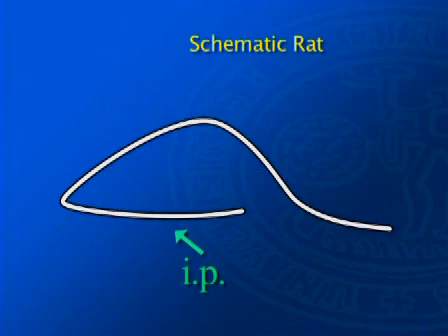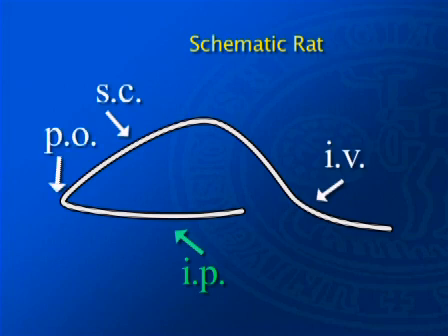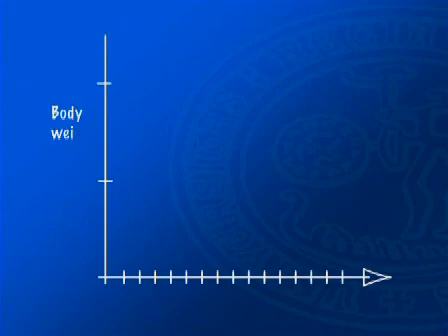The administration of angiogenesis modulating therapeutic modalities imitates a clinical therapeutic situation. One or more angiogenesis modulating factors can be administered systemically, subcutaneously, intravenously, or orally, for example. This mimics a clinical treatment situation in that the effect not only of the parent molecule but also of its metabolites can be studied. The system permits a certain degree of control of the toxic effects of systemically administered angiogenesis modulating agents.